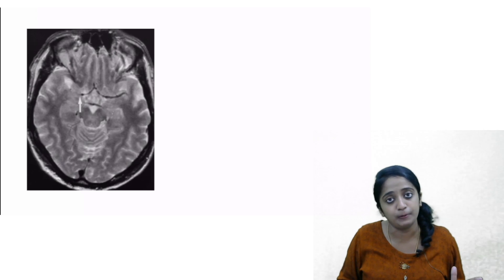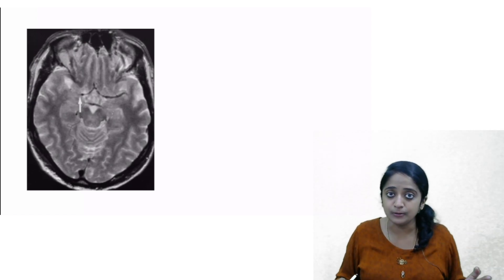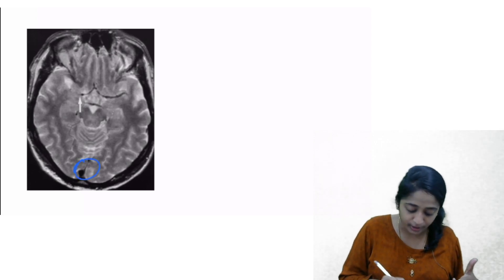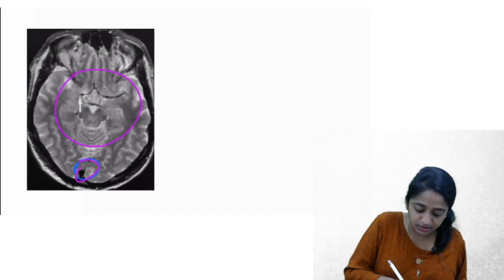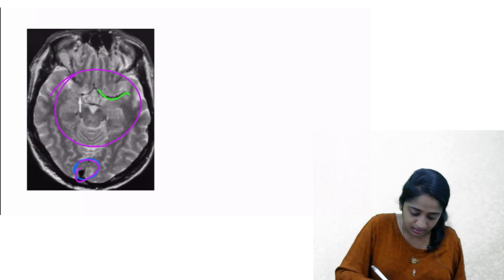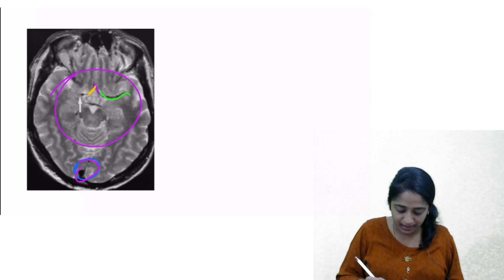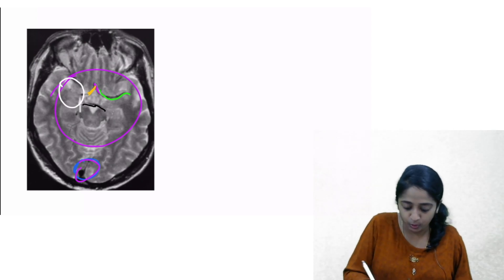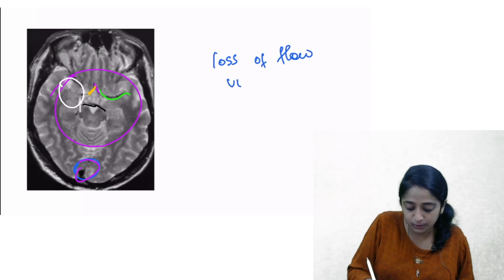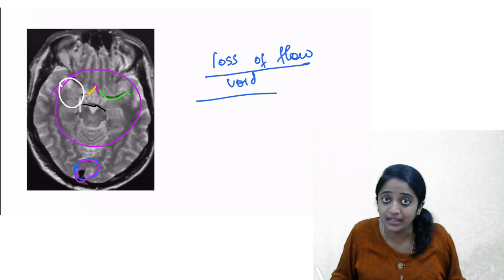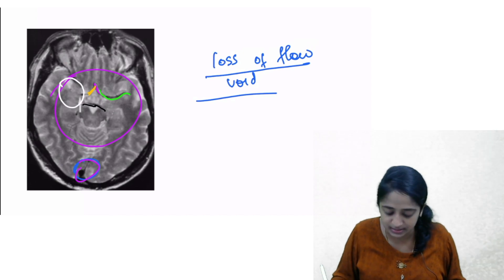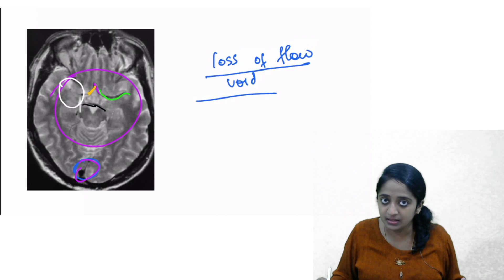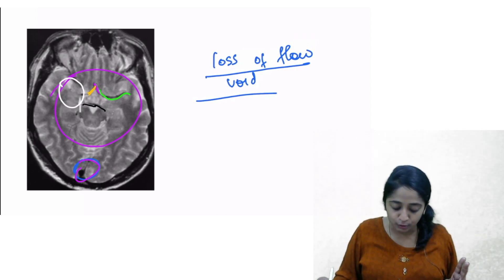The second sign in FLAIR was the hyperintense vessel sign. The corresponding sign in T2-weighted imaging is loss of flow void. How should vessels appear in T2? They should be black — flow voids. The superior sagittal sinus is black; left MCA is black; left ACA is black; right ACA is black; posterior cerebral vessels are black. But the right MCA — it is not seen. There is loss of flow void, which is an indirect sign of abnormality in that vessel. This is the counterpart of the hyperintense vessel sign in FLAIR.